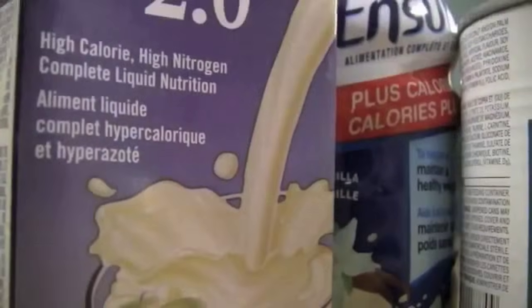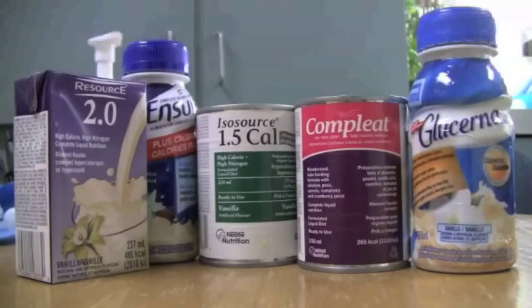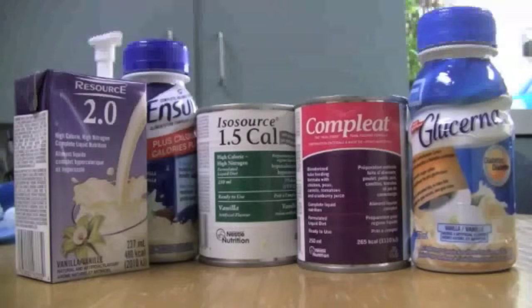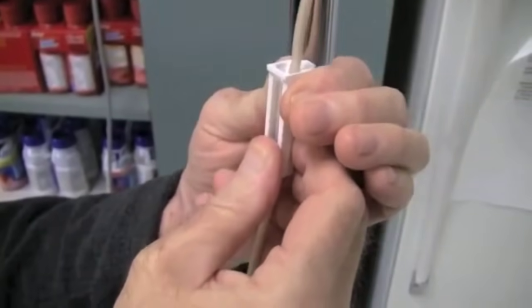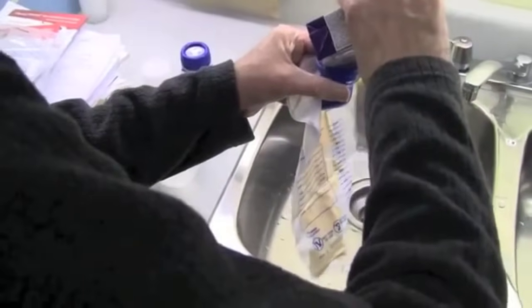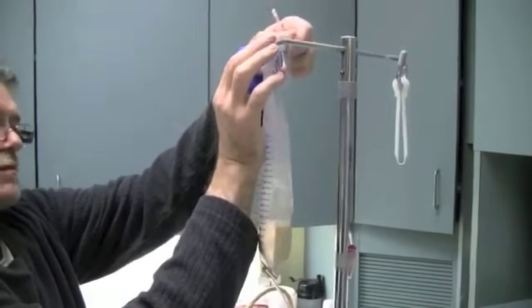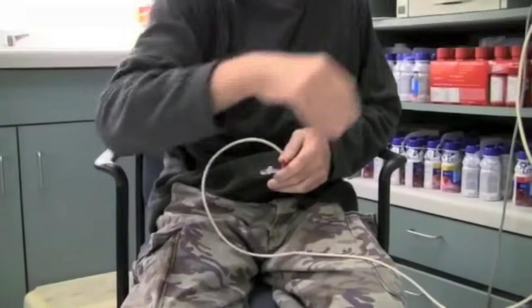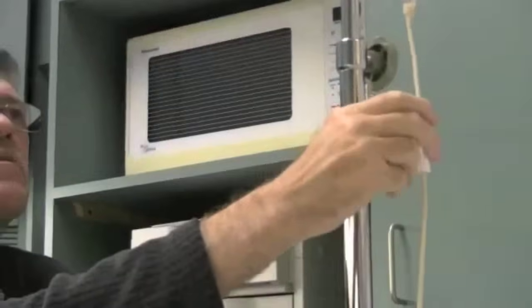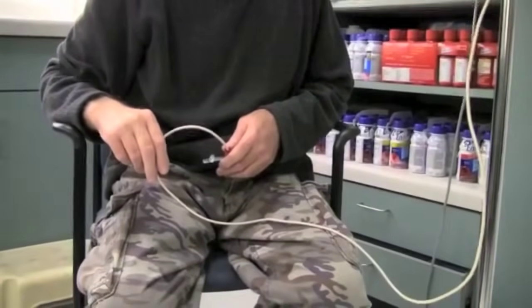Now you're ready to set up your feeding set. First, shake the formula well. Make sure you wipe off the top of the formula can with a clean, damp paper towel, and don't forget to check the can for the expiration date. Close the roller clamp by rolling the clamp down on the feeding set. Pour the desired amount of formula into the bag and hang it above head level. Remove the plastic cover from the tip of the feeding set and insert the tip of the feeding set into your feeding tube. Open the roller clamp by rolling it up to start the feeding. You can adjust the rate by opening and closing the roller clamp — simply roll it up or down to slow down or speed up the rate.